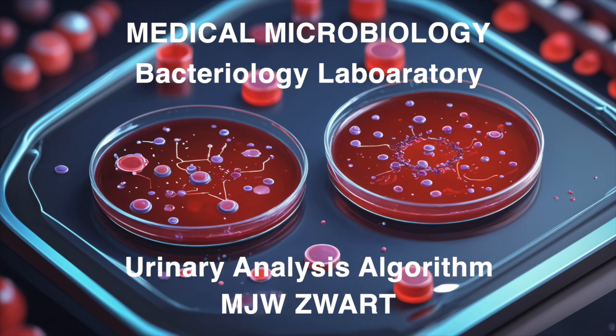So the Q-score helps you decide if a culture is needed at all. And then the Gram stain helps you narrow down the suspects, guiding you toward the most appropriate culture media. It's a powerful combination. And this brings us to the next step in the algorithm: choosing the right agar plates for your culture.